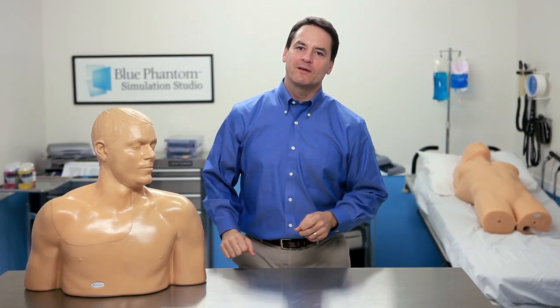We're confident that this model will help you in your pursuit of improving patient care through effective training. We look forward to providing you with superb products and uncompromising customer support. Blue Phantom gives you the confidence only experience can offer.